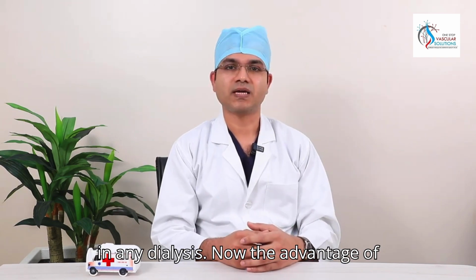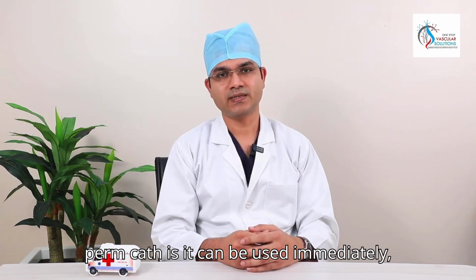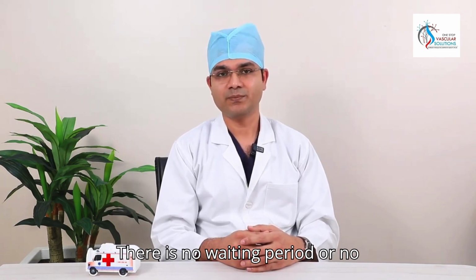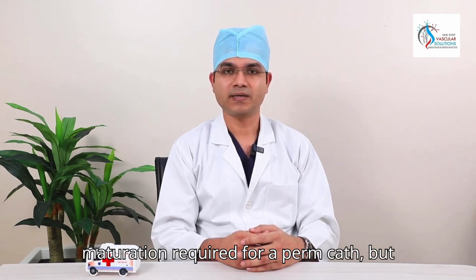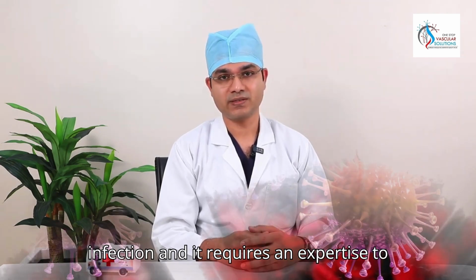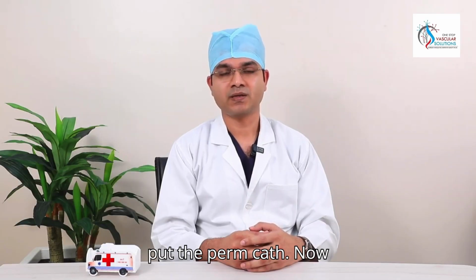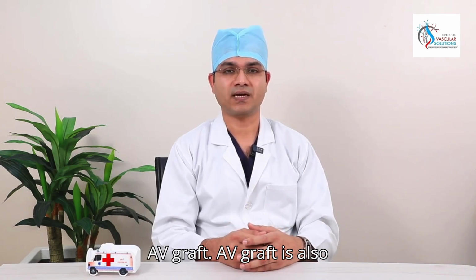Now the advantage of perm cath is it can be used immediately, say on the same day on which it is kept. There is no waiting period or maturation required for a perm cath, but it has its own disadvantages: it is costlier, it has high chances of infection, and it requires expertise to put the perm cath.